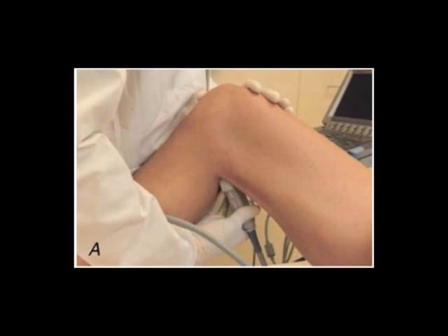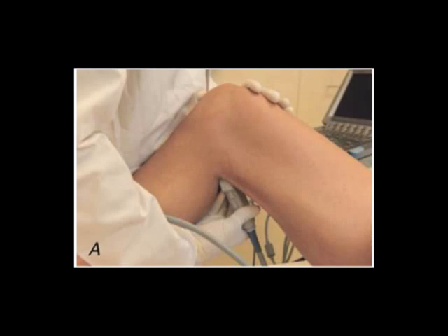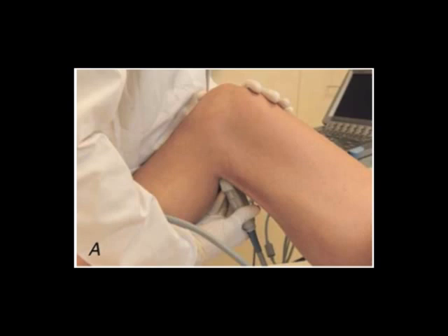I've found it easiest to acquire these images with the knee in about 90 degrees of flexion. Sometimes you'll need to ask for help in order to stabilize the patient's leg in such a manner. I would also encourage you not to press too hard in this area, as the low-pressure popliteal vein is relatively easy to compress and you can fool yourself if you're applying too much pressure.